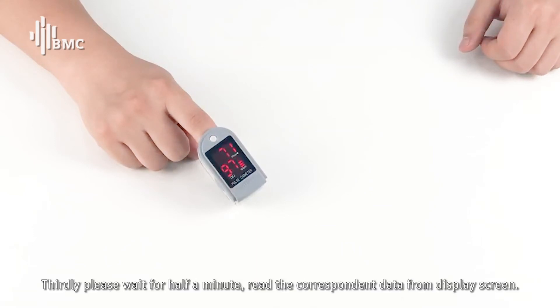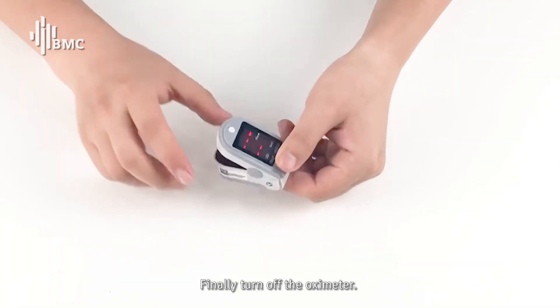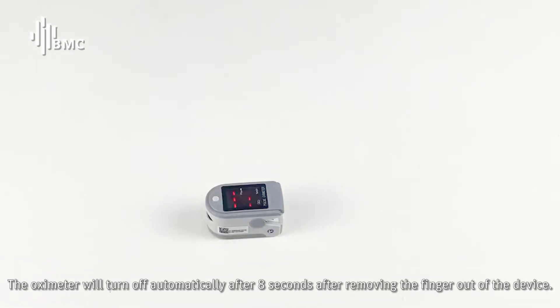Thirdly, please wait for half a minute and read the correspondent data from the display screen. Finally, turn off the OXYMETA. The OXYMETA will turn off automatically after 8 seconds after removing the finger out of the device.